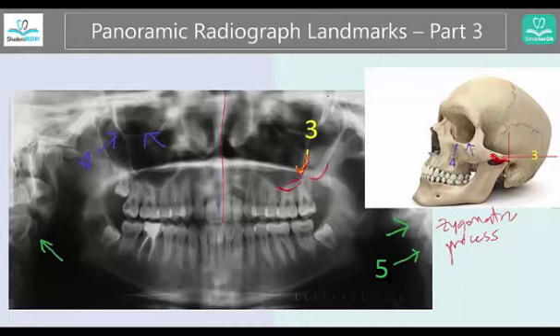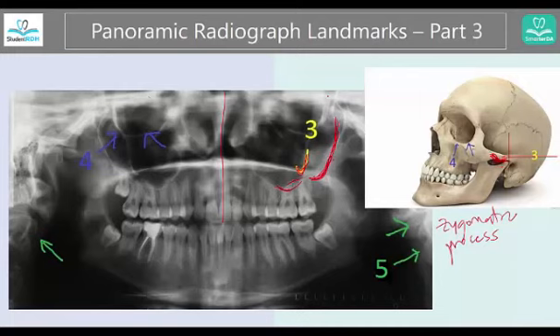You might go to your board examination and see that this U shape looks a little different with every panoramic image. But remember that this is usually located right above the maxillary molars, and it is not as far to the side as this area, which is probably the maxillary sinus lateral walls. And it doesn't come all the way down like this, because this is the floor of the maxillary sinus.